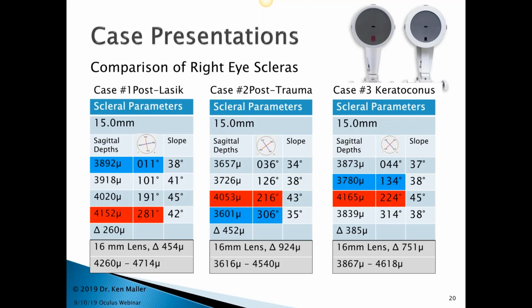The two real lines in the sand that would get me over the edge to consider a scleral design is, number one, the study from out of Pacific by Frank Zhang a couple of years ago showed that elevation differences on a cornea of 350 microns or less can be successful in a corneal design. I think it was 88% of the time, and that's a pretty high success rate. The other thing is 350 microns of elevation differences between a peak and a valley on a cornea is actually pretty dramatic. If you go back and take a look at a lot of the cones that you see, a lot of the cones don't even quite get close to that type of elevation difference.